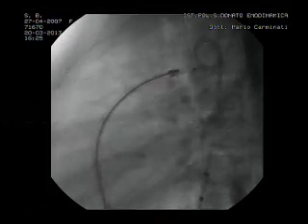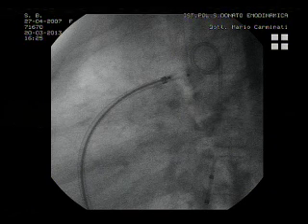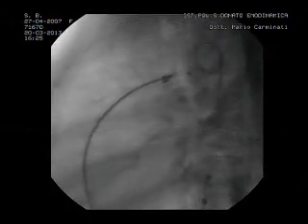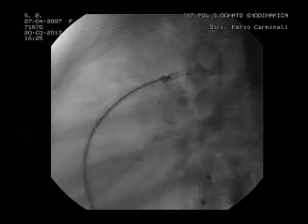You see, because of the tension, the sheath and the wire are taking the device back downwards. But I think that when deploying the rest of the device, it will adjust itself. I'll do it on scene. Let's do another angio here.